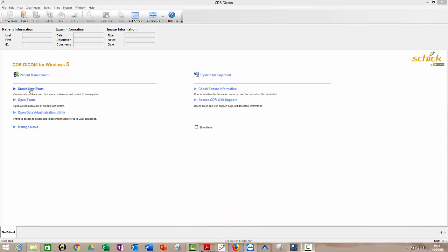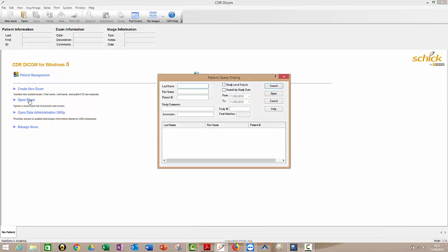Now you're only really going to use these two things, either create new exam or open exam. So think of that like patient, create new patient or open patient. So if you wanted to see a patient that you've seen before, just click on open exam, type in their last name or first name, search for them and you will find them.